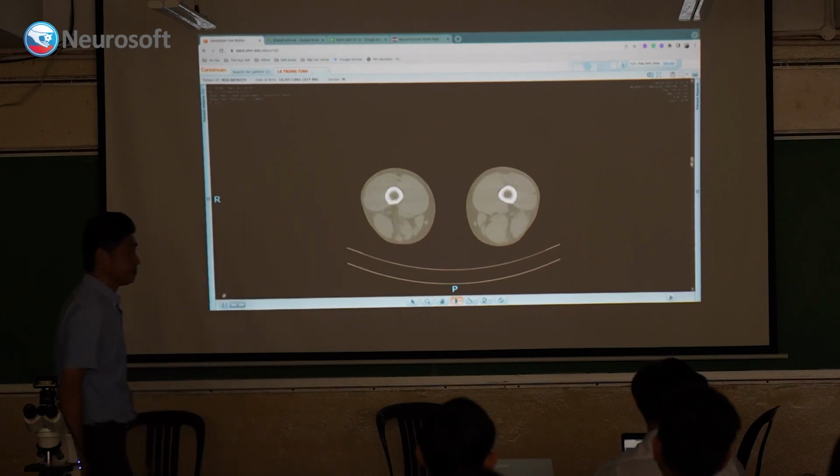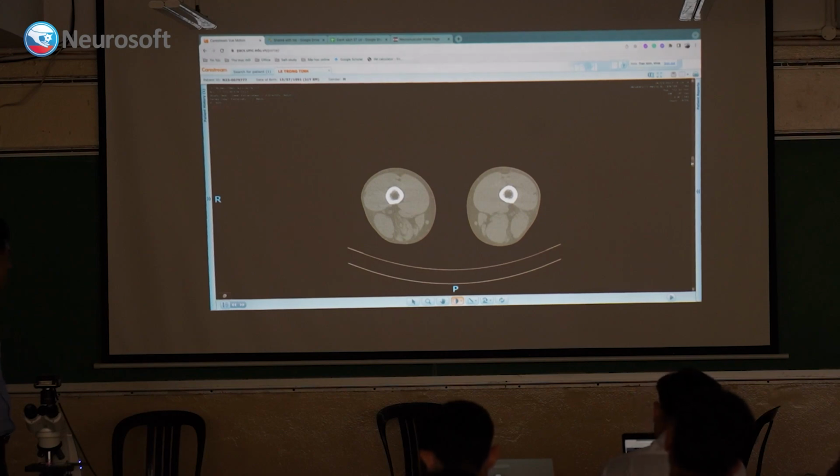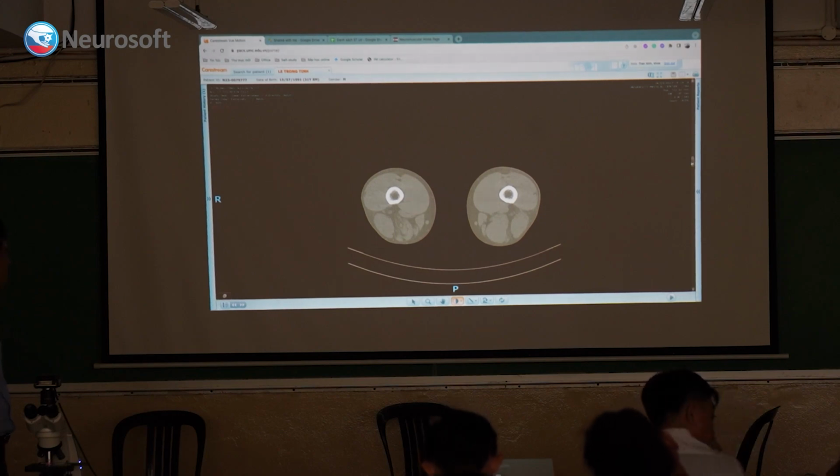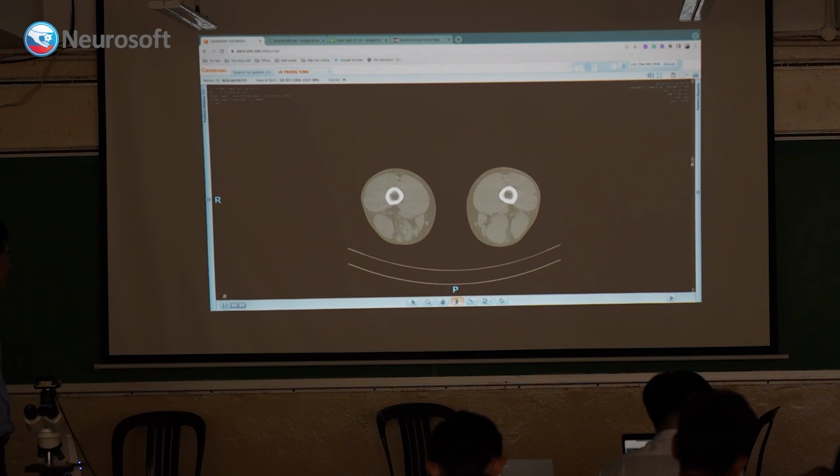So remember you were saying about the problems with MRC testing, right? The other problem that we have as clinicians is that when your foot is very weak, your hip can look weaker than it is. So we often overrate the weakness of the hips. Yeah, exactly. While here you can see the gluteus is quite normal, right? So that's why MRI or CT is better, because in clinical exam, when the foot is very weak, we often overrate proximal weakness. Muscle imaging is very powerful actually.